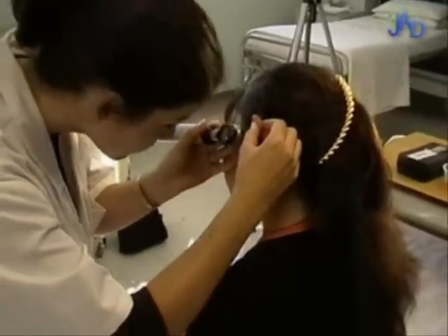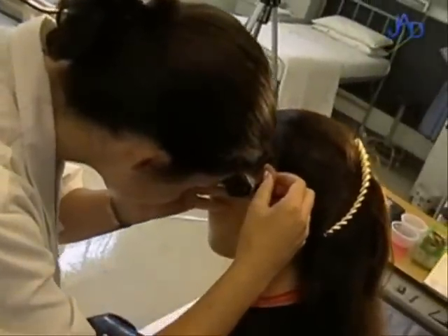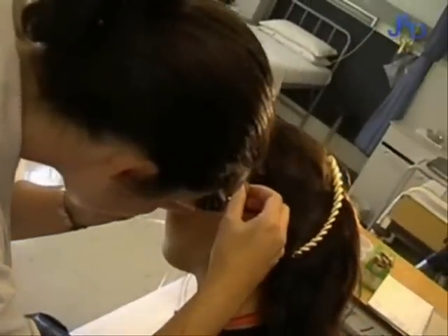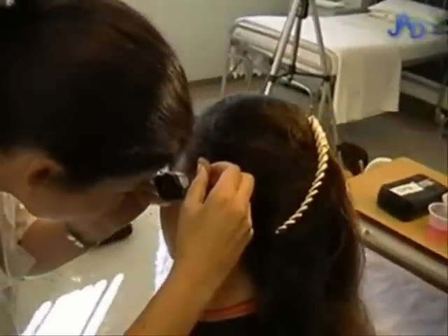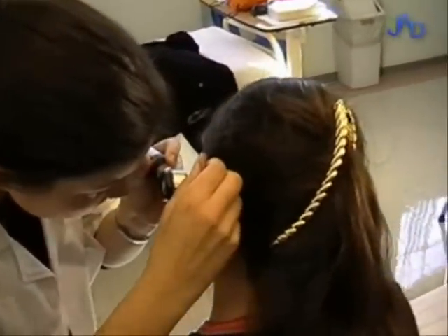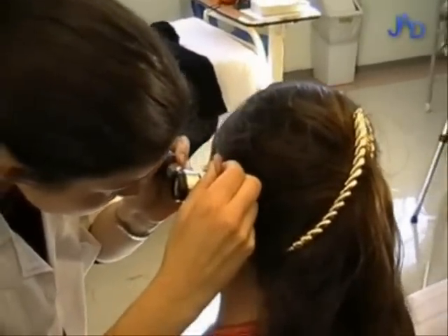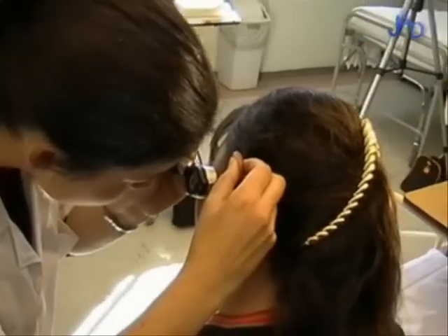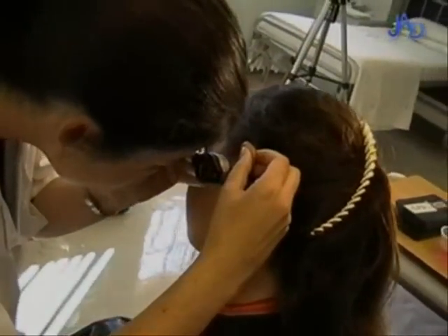The otoscope is carefully placed in the entrance of the ear canal. The auricle is gently pulled backwards to facilitate the examination and to improve visualization of the eardrum.